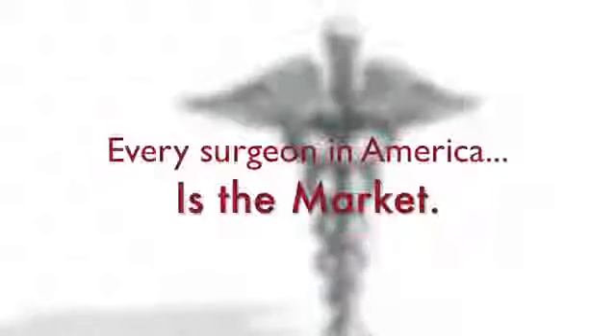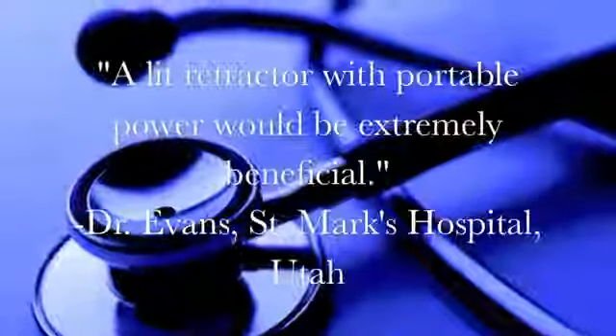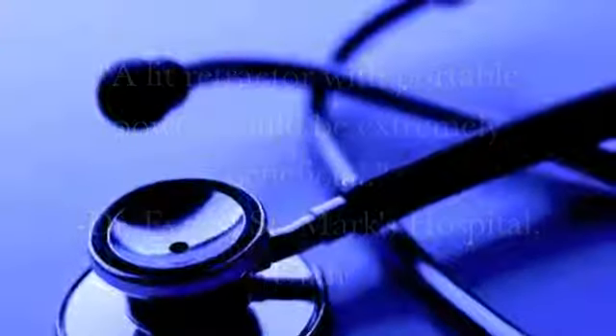As the design continues to progress, it will be able to illuminate an even larger area with more intensity. The market for this device is widespread. Dr. Evans at St. Mark's Hospital stated that a lit retractor with portable power would be extremely beneficial.